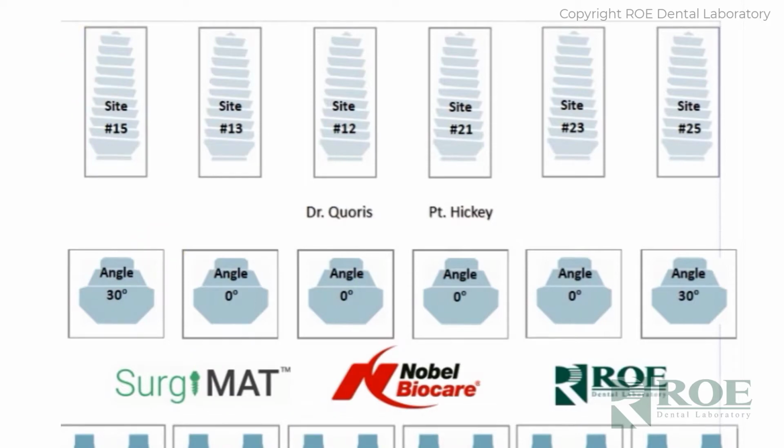But this is about 12 inches by probably 20, and it goes on the counter, and the doctor will place all the implants here, place the multi-unit abutments here, and then all the temporary cylinders. And you can see it's by implant site, it's by angle, and then of course the dual temp cylinders for the pickup of the prosthetic, and then a second pickup of the rapid appliance.